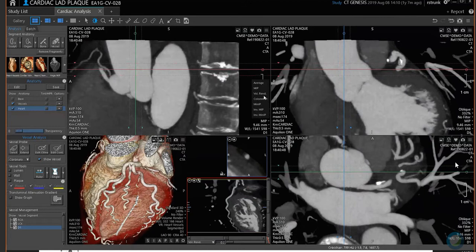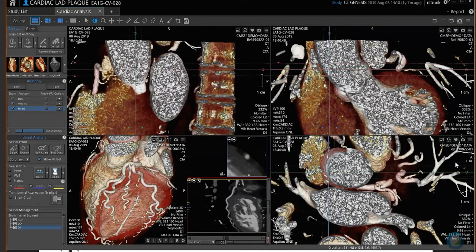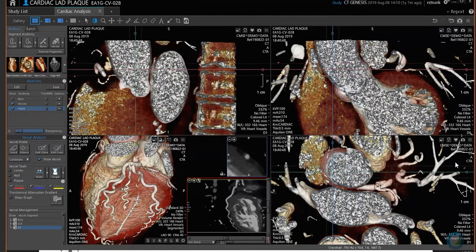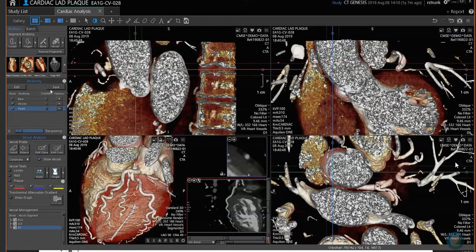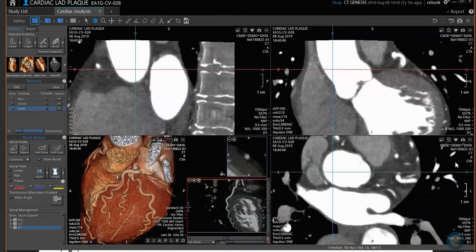MIP is a maximum intensity projection — you'll notice no difference when you're at 1mm, but when you get thicker, all the bright structures are projected outward, so it's really looking at anything with the highest Hounsfield units.